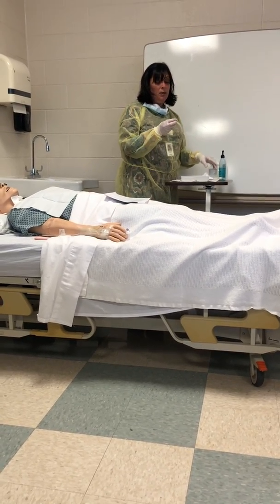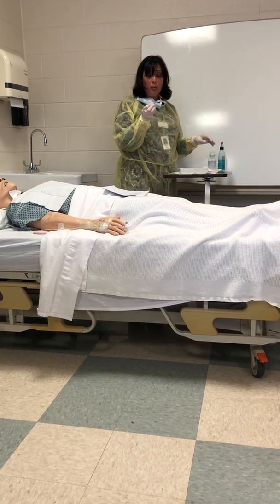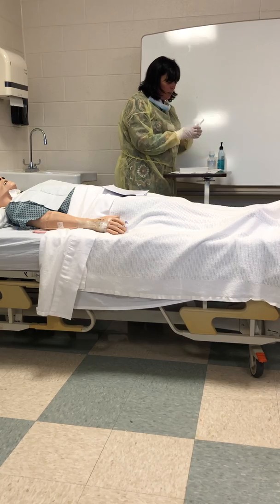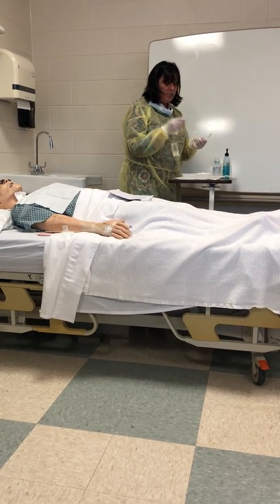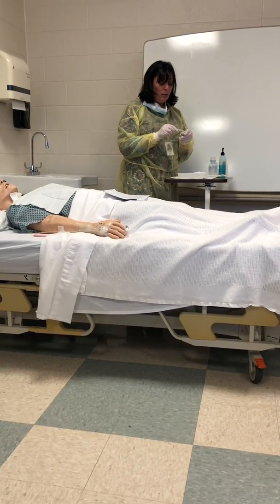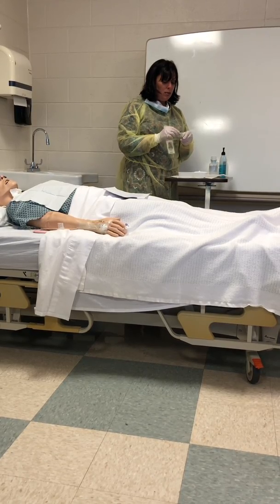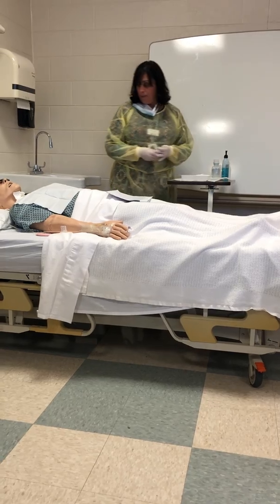So really, these things dry off pretty easily. You just want to shake it out. Just make sure there's no bubbles of fluid down inside of there. I only dried it off because I don't want Miss Baker mad at me. Just blow it out. If you have a bubble that won't shake out, you can take one of these dry ones and shove it up inside of there. Let's try that end. And oh, look, I got that bubble.